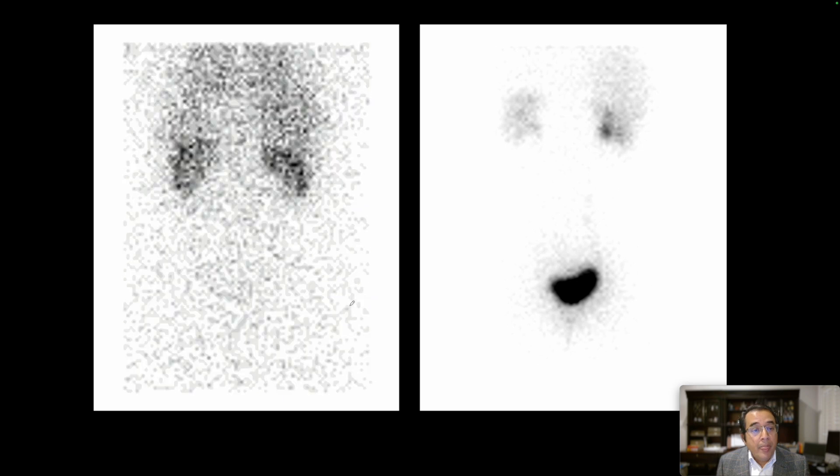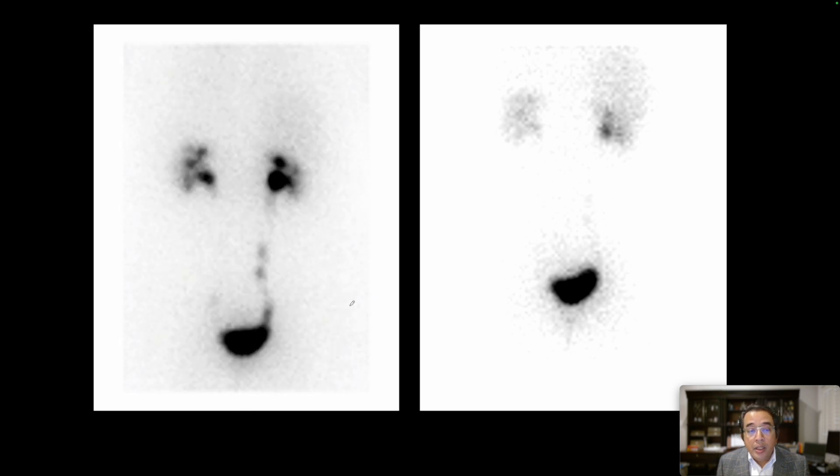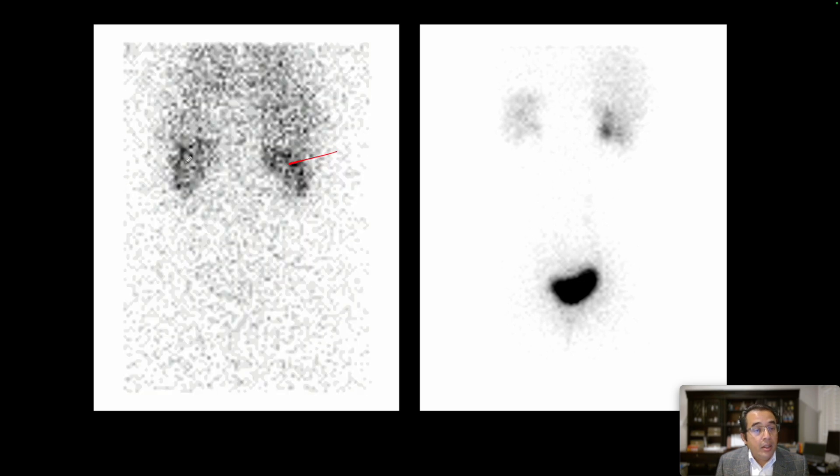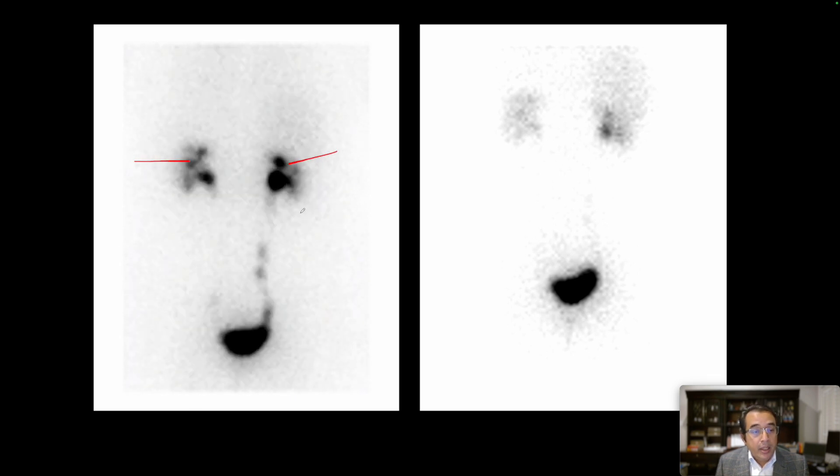When we see something which looks like stasis of urine, then we inject these patients with Lasix and acquire more images and evaluate them for obstruction. So this is the dynamic image showing initially the blood flow into the kidneys, seen right there in the left and the right kidneys.